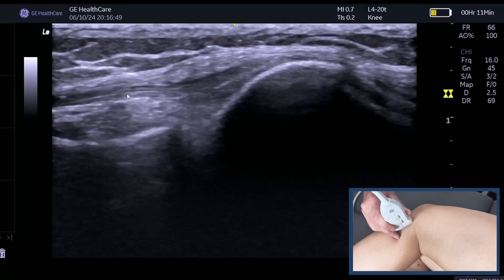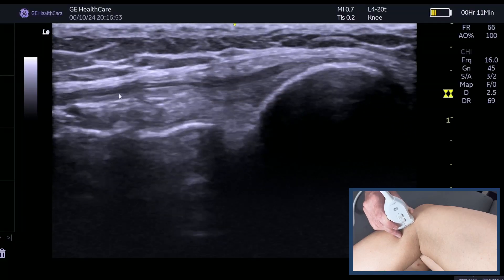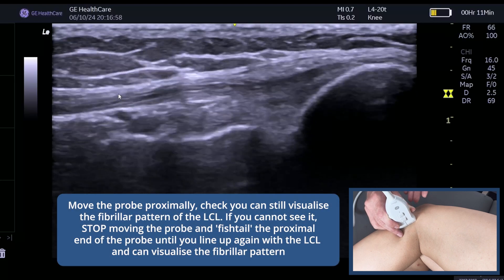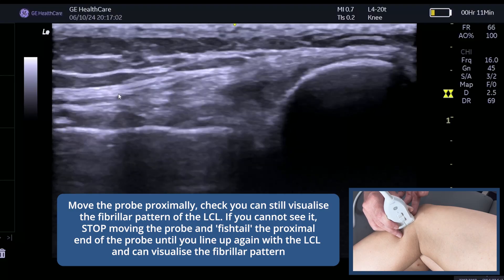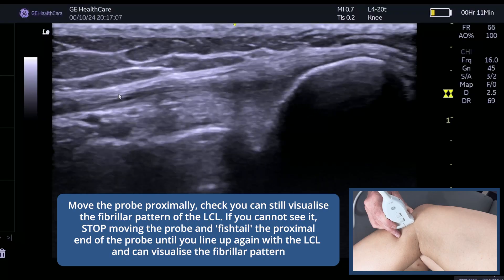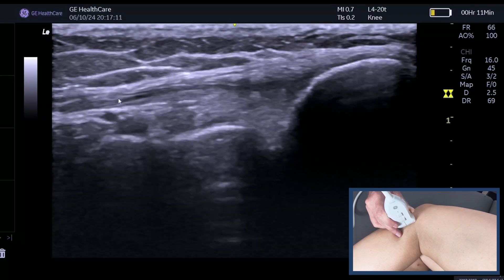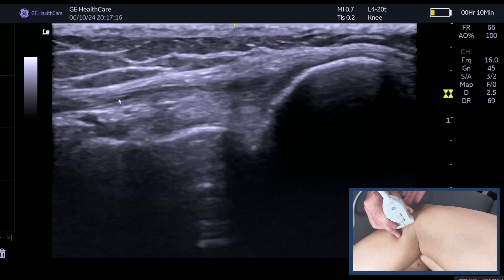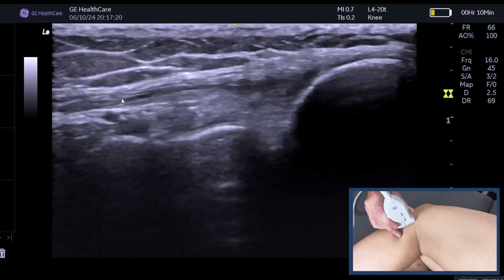Can we see here the nice fibula pattern? So this here is the LCL, and I'm just following it by moving the probe proximally and checking that I've got that fibula pattern. If I don't, I will just fishtail either anteriorly or posteriorly until I can see that fibula pattern. You won't necessarily get all of the LCL in one nice footprint on your image, so you may just have to have a look at it as you go.